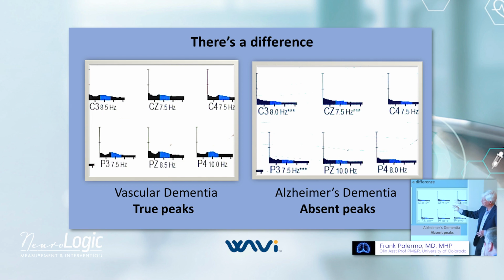So when I saw that, I said, see, you don't really have dementia, you've got something, but I don't know what it is. It's not great, but it's not horrible, right? So let's do all the metabolic stuff we can do, and that's why I sent them out. Anyway, I think it's very helpful. It's nice that there's not too much information, but there's enough to make a decision from a medical standpoint.